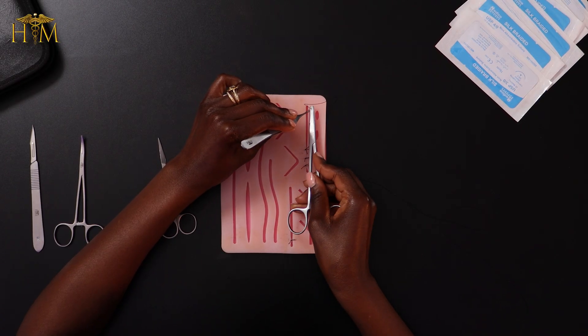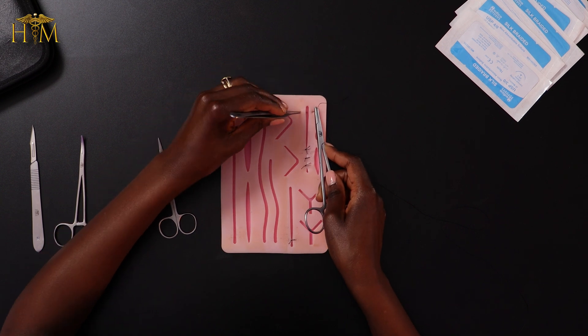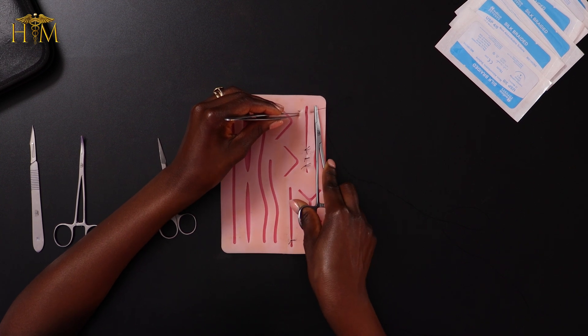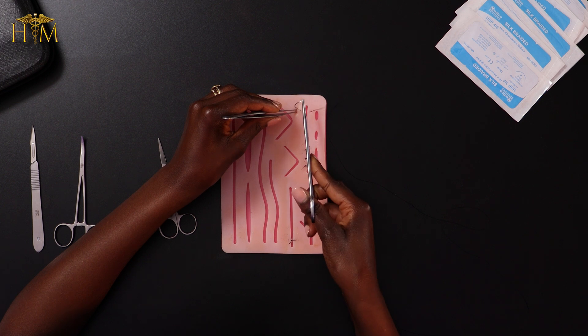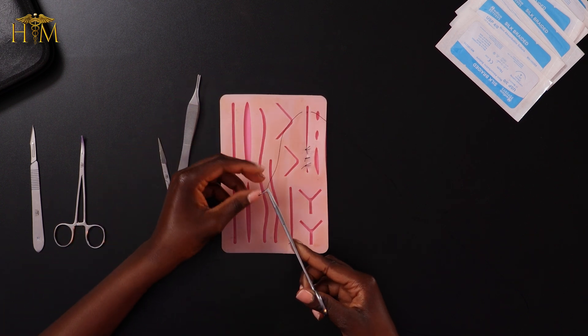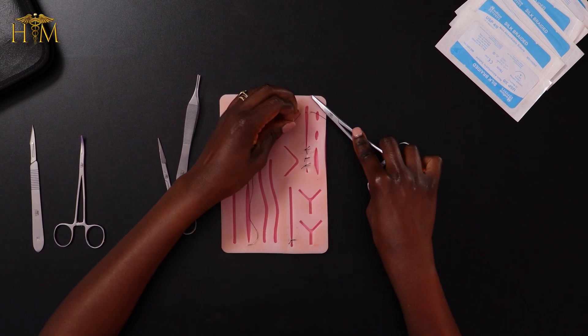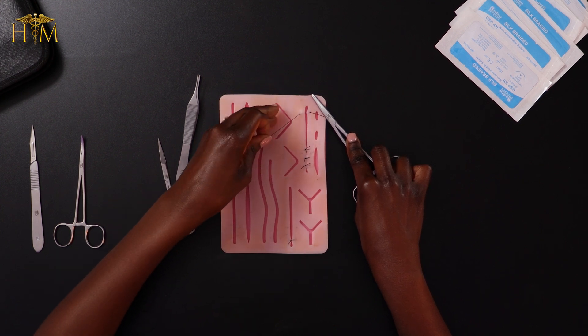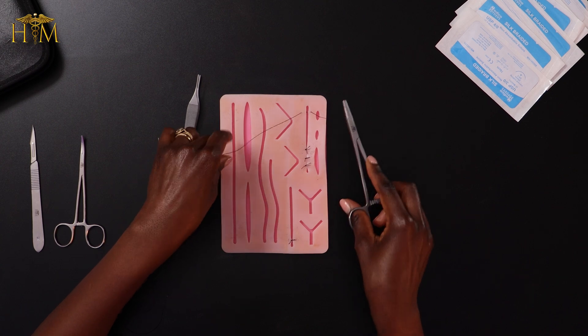The beginning of the running suture is actually exactly the same as how we start the interrupted sutures. Using my forceps to help me, I put the needle in a few millimetres away from the edge of the wound, and then that advances through. Come out the other side, using my forceps to help me advance the needle until it's all the way through. Then I'm going to drop the needle and use my fingers to pull the suture — just a few centimetres on the other side. Then I'm going to tie it with the instrument tie, exactly the same way as we did for the simple interrupted suture.